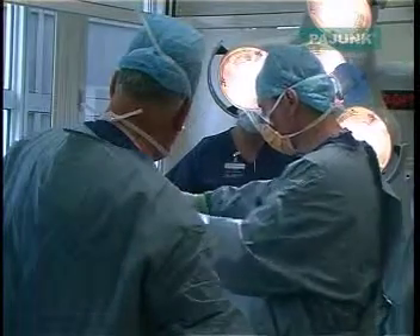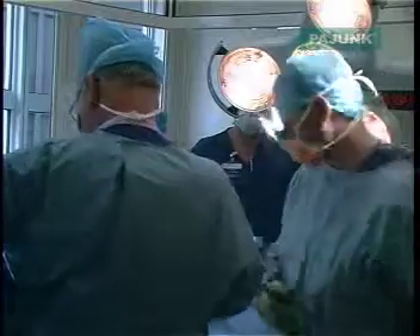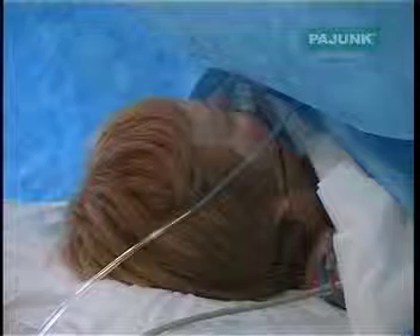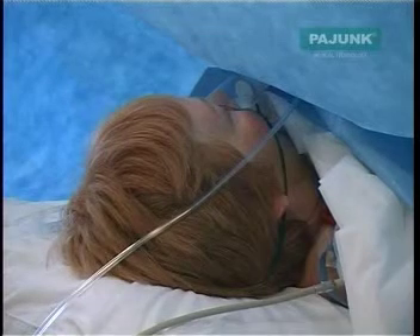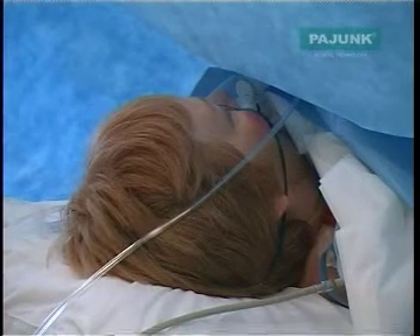Another group which this technique is particularly suited to are patients undergoing total hip replacement in the lateral position. These spinal catheters can be used to provide very effective post-operative analgesia if an infusion is run. However, we feel that continuous spinal analgesia is only suitable in a high dependency setting and should not be used on the general wards.